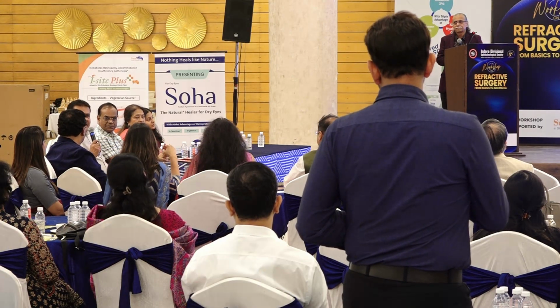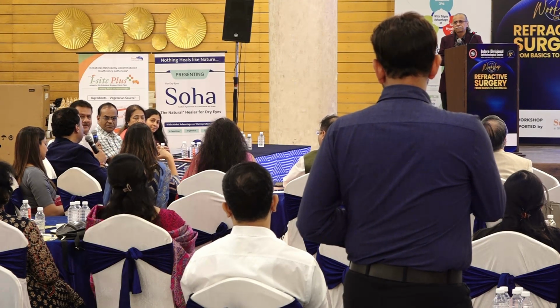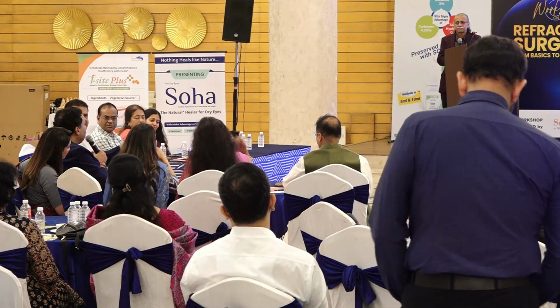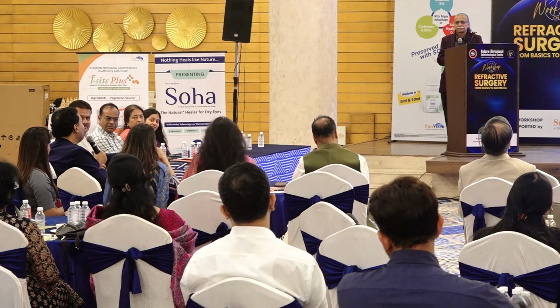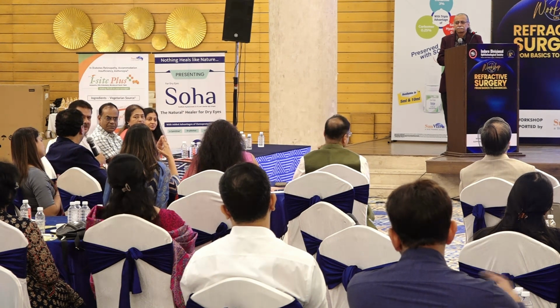Maybe in future we can get intraocular lenses also on a ray tracing type. All the lenses today have some or other ray tracing principle built into them. So if you use a ray tracing laser, ray tracing lenses and ray tracing driven biometers, that is the way to move forward.